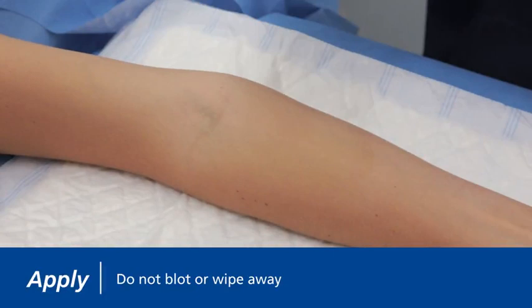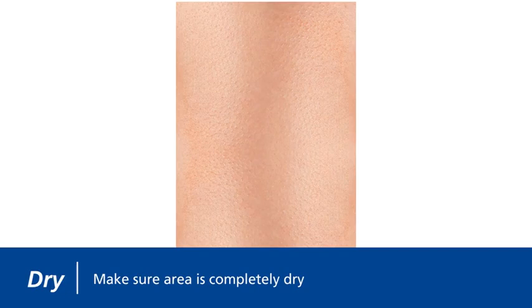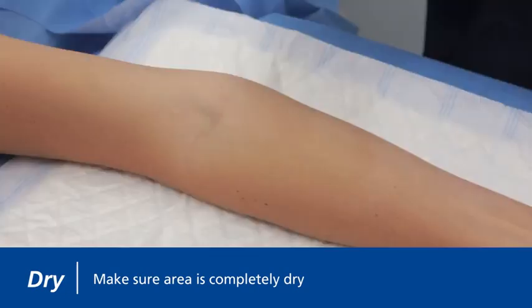As it dries, the sheen becomes less apparent and takes on a matte appearance. For optimal adhesion, make sure the area is completely dry before commencing procedure.